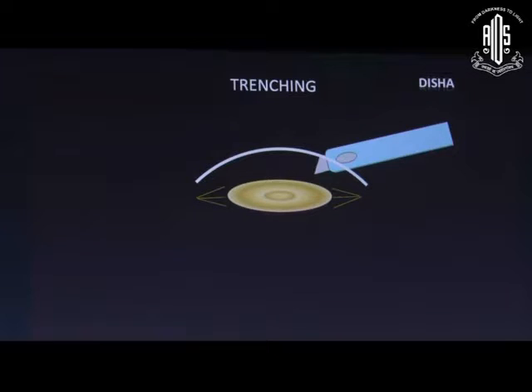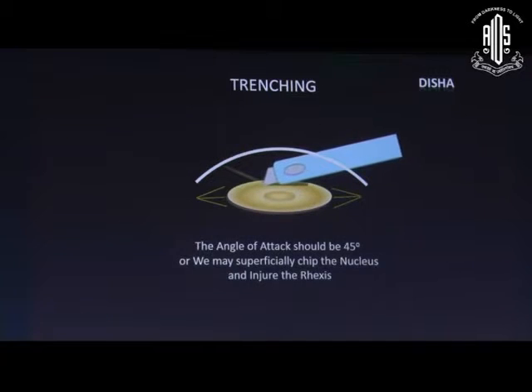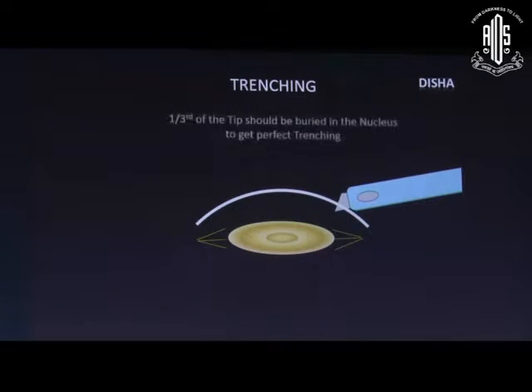The angle of attack — that is, the angle between the anterior surface of the lens and the phaco needle — should be 45 degrees. If it is less, we may superficially chip the nucleus and also injure the rhexis margin. One-third of the tip should be buried in the nucleus to get perfect trenching.